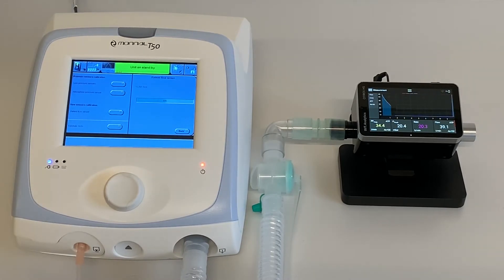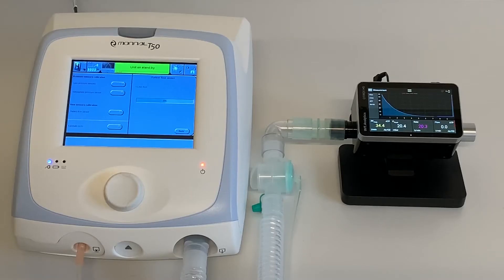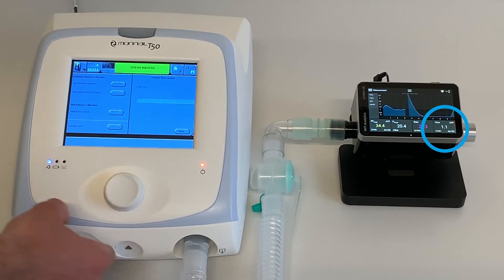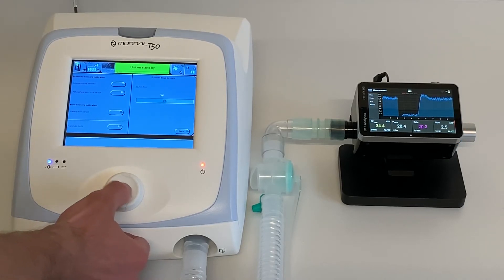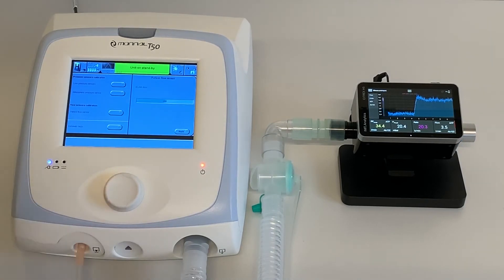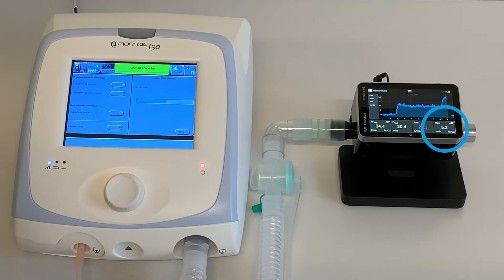Verify the T50 is delivering a flow of 1 liter per minute on the Citrex, then press the control knob to confirm. Verify 2 liters per minute and confirm. Verify 3 liters per minute and confirm. Verify 4 liters per minute, then press the control knob to confirm. Verify 5 liters per minute and confirm.